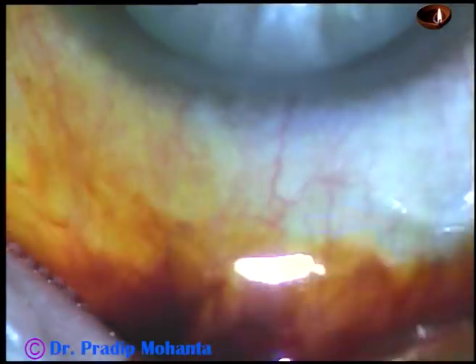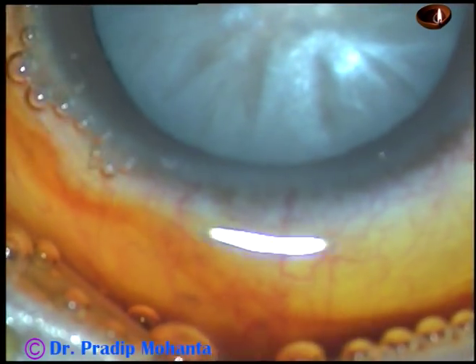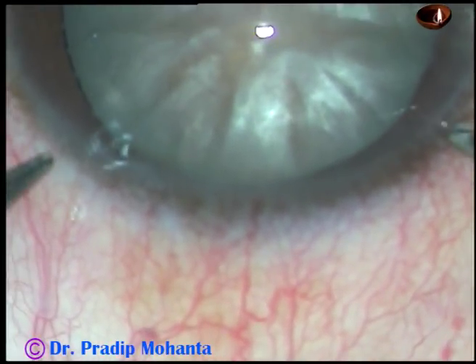Superior rectus bridal suture has been applied. The ocular surface is being thoroughly irrigated, applying povidone iodine 5% and Ringer's lactate.